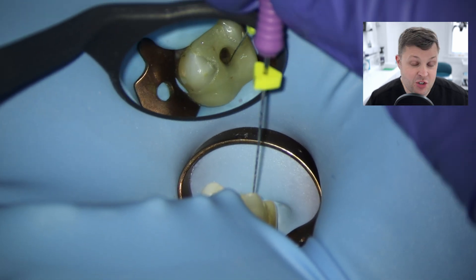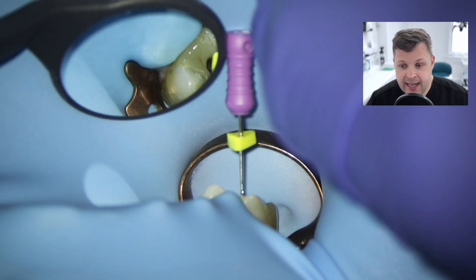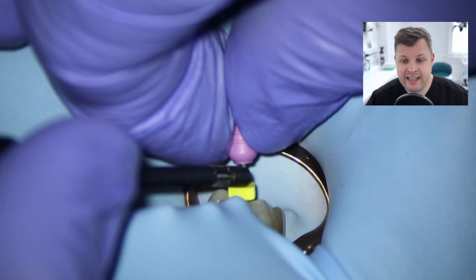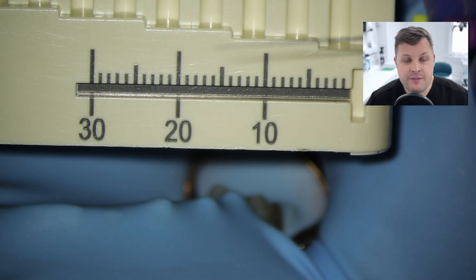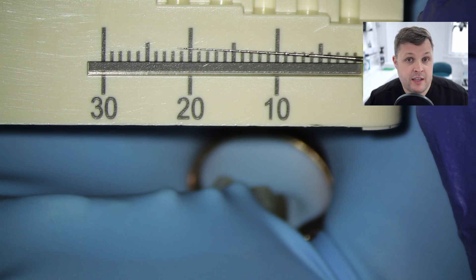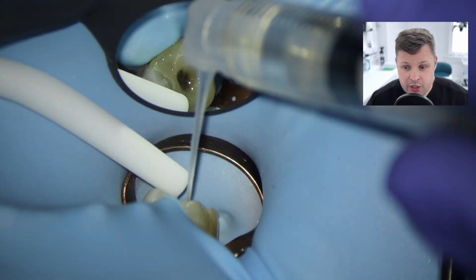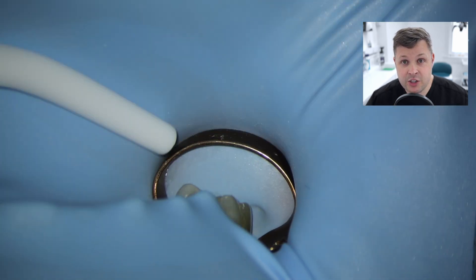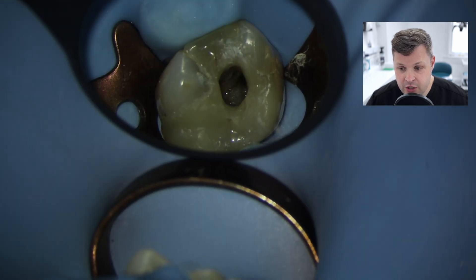We're going to gain the working length of DB, and straight away I'm not going to mess around with a size 10K file - I'm going to use the D-finder, and this slips straight to length really nice and easy. We find the working length here is 21.5. Once we've gained the working length, it's the same protocol as before: glide path file at the zero reading of 21.5, and in this case I felt we needed to use the size 20 again to open up the canal a little bit for the 25 to reach all the way to the working length. All three canals are now shaped.